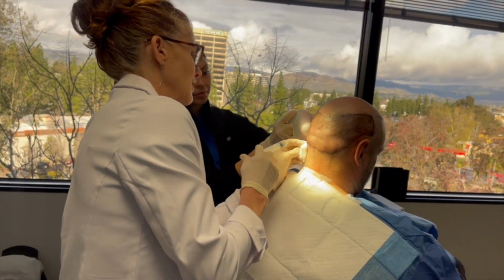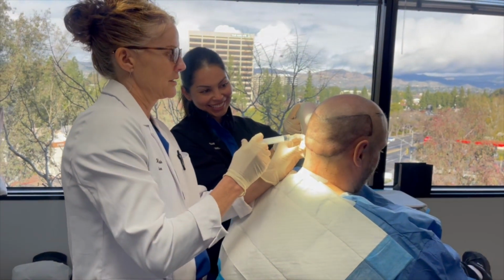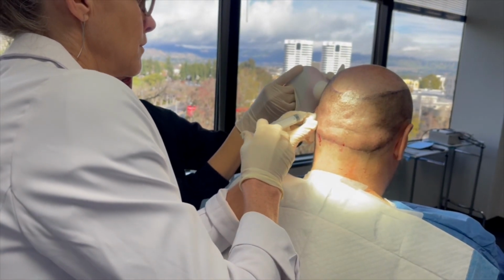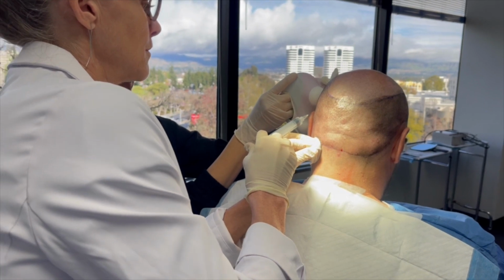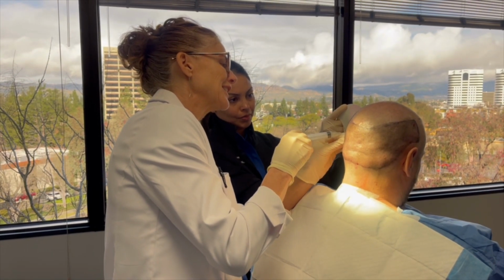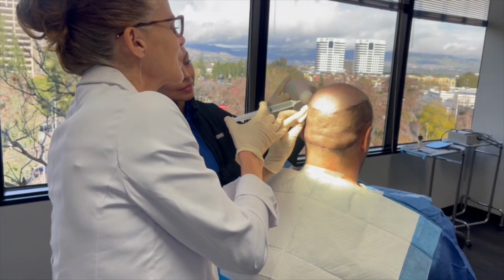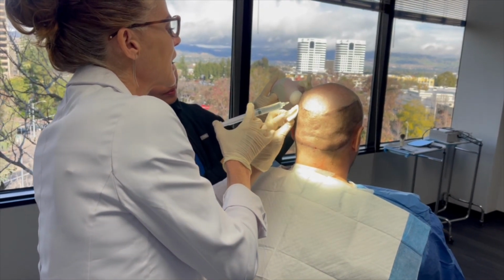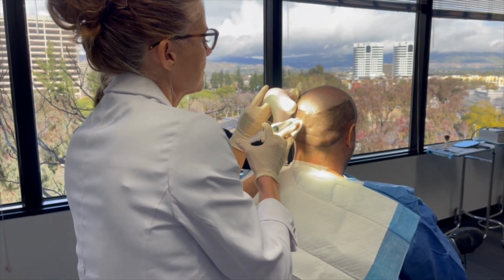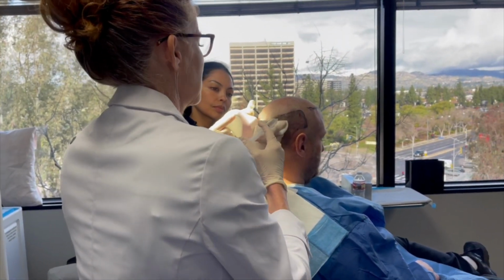There's the distractor. Is the distractor helping you? No? It feels good? Okay, well, we got one positive. This is what we call a ring block. Okay, so we are going up above. Yeah, the vibration definitely helps.